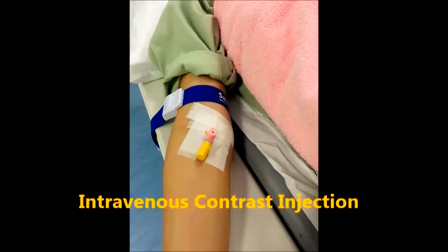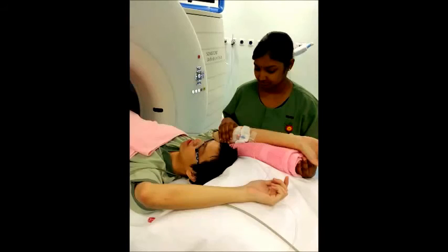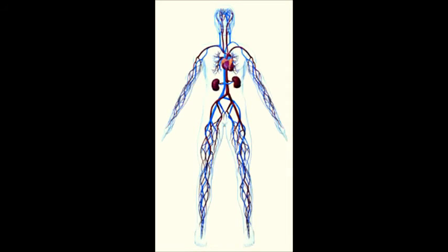We will need to put a needle in the vein on your arm and contrast media will be injected through the needle into your body. It will highlight your heart and the blood vessels.